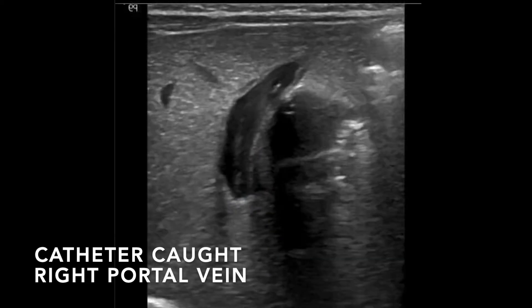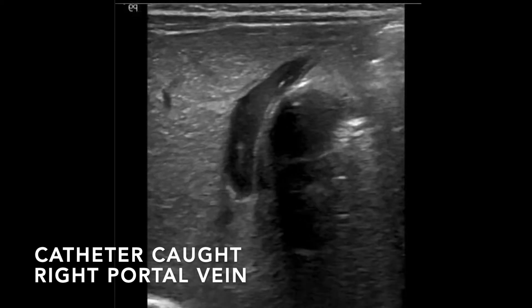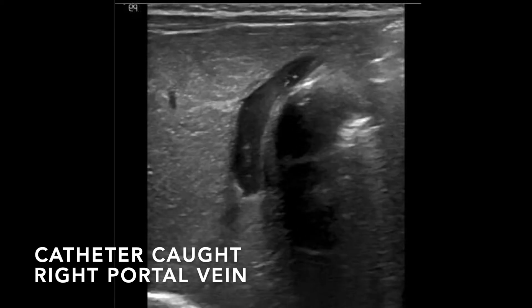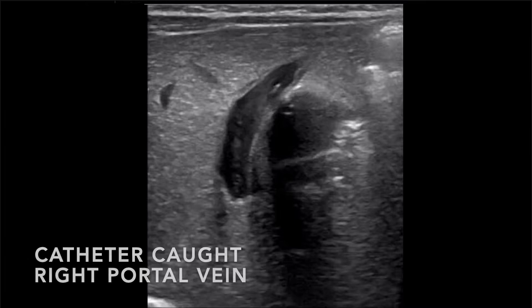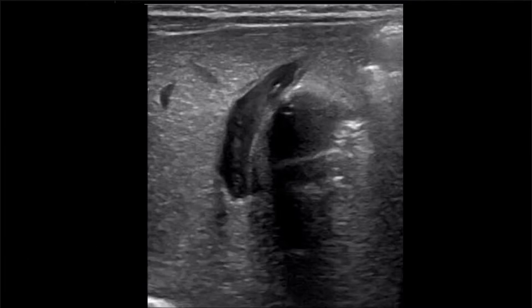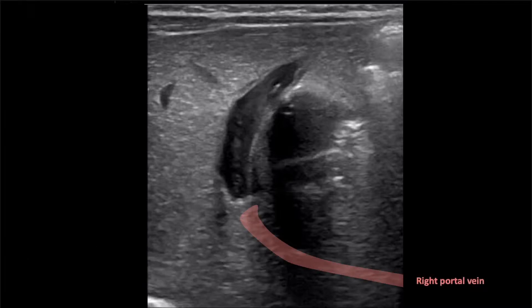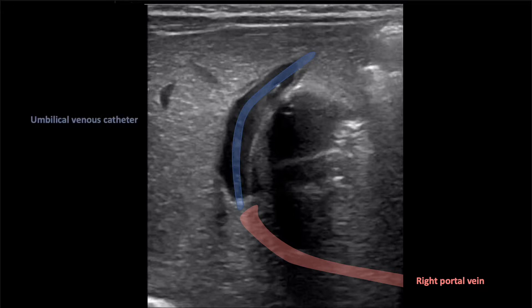Here, the UVC can be seen dropping posteriorly through the portal sinus. The right portal veins join the portal sinus more posteriorly, and are usually out of plane relative to the left portal veins, umbilical vein, and ductus venosus. The right portal veins are highlighted here in pink, and the UVC again in blue.